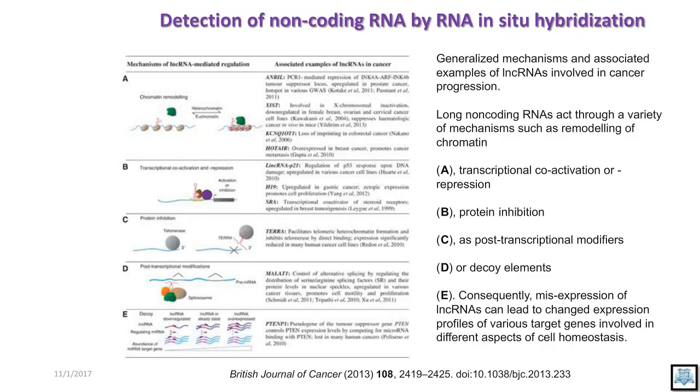This type of tumor molecular heterogeneity has been studied by different approaches like next generation sequencing. People have done microdissection of individual tumor foci, and they have done next generation sequencing.